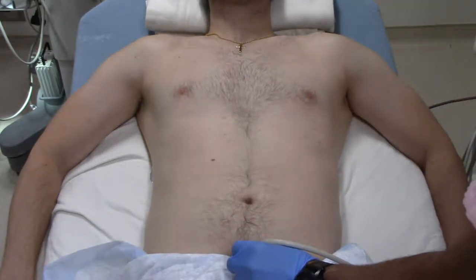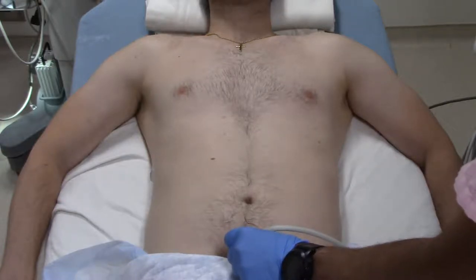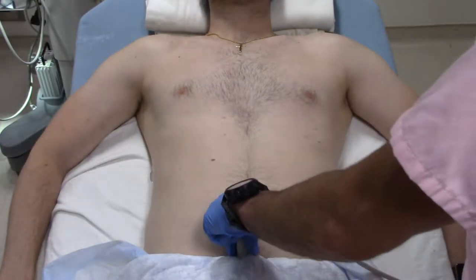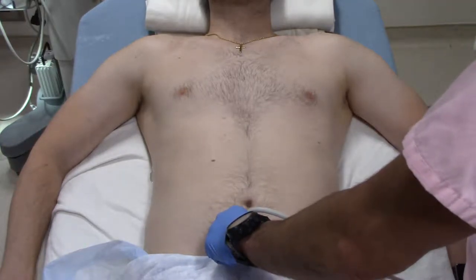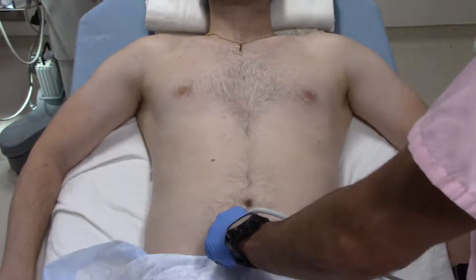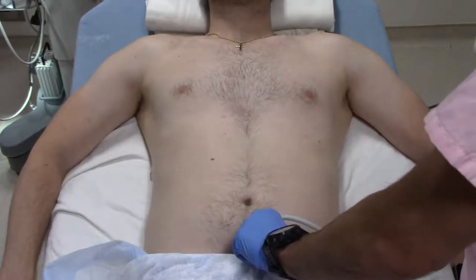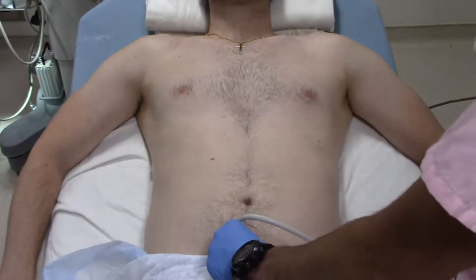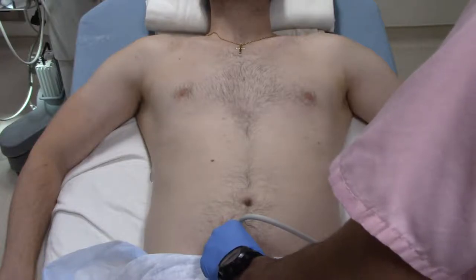Rotate the transducer 90 degrees clockwise up towards the patient's head. Looking down into the pelvis, we see the bladder. We're also going to see the pubic symphysis with shadowing behind it — that's where we know we're in the right place. Hit acquire, fan to the right, fan to the left, making sure we see everything. Now we've got good bladder and pelvis views looking for free fluid.